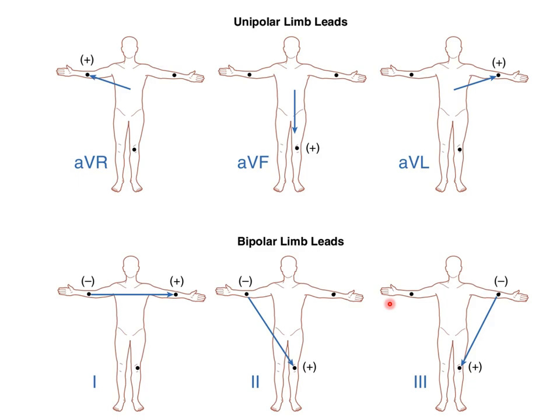We need to look at the EKG briefly. It's a form of imaging. It's like imaging the voltage pattern on the surface of the patient, right? If the patient was standing in front of you and you could make a color mapping on the surface of the patient, and that mapping equals the voltage difference between some ground that you put on the patient and every other position, you would see an evolving pattern over time of this voltage on the surface of the patient. And that is a projection of the voltage which is in the myocardium, and it projects through the tissue out to the surface.